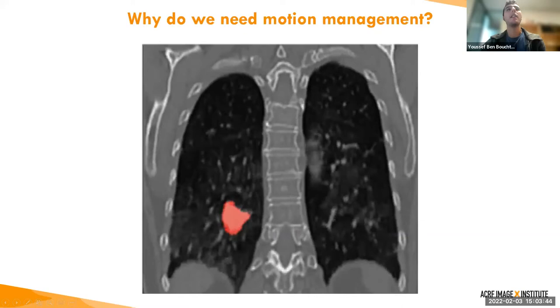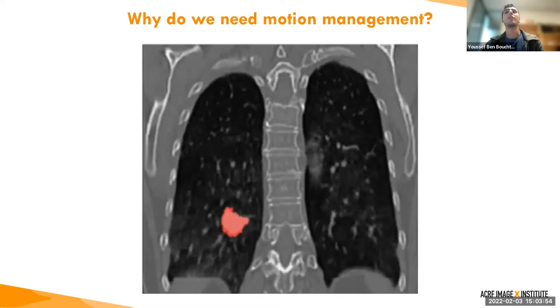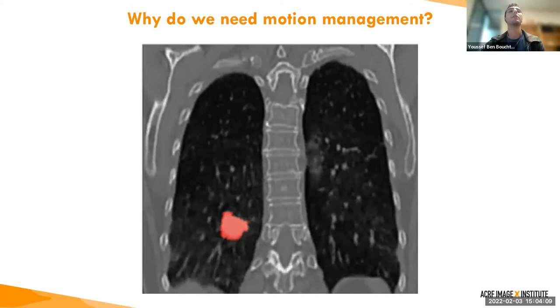The previous slide showed an example of motion from fraction to fraction — that's called interfraction motion. But motion also occurs during treatment, so intrafraction motion. This is an example of a lung tumor that is just moving as the patient is breathing. It's important to address that, otherwise the tumor risks being underdosed.